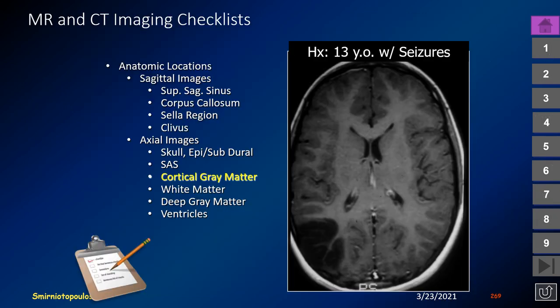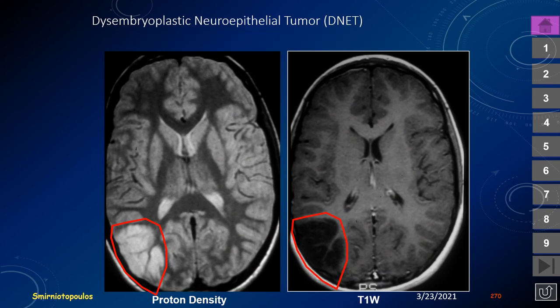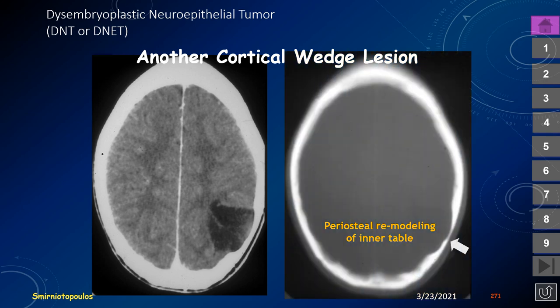For cortically-based lesions, consider clinical context. A 13-year-old with seizures is not the typical presentation for cerebral ischemia. A bubble-like cortical wedge appearance suggests dysembryoplastic neuroepithelial tumor, or DNET. Another DNET shows periosteal remodeling of the inner table of the skull — a sign that can be produced by any superficial mass lesion. Oligodendrogliomas can also arise in the cortex with a long clinical course before presentation and may show similar inner table remodeling.